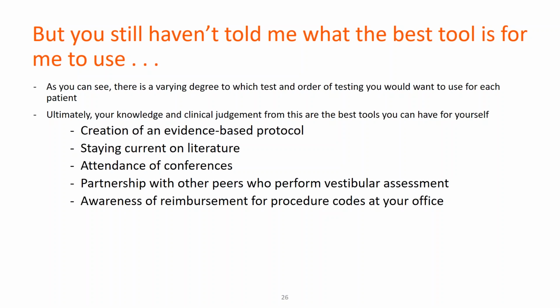Great. And you may incorporate gaze testing to that just to show that there is no other central sign going on. I think ultimately your knowledge and clinical judgment are the best tools that you can have for yourself. So I always, for myself, try to keep as much in touch with the literature as I can. But I think creating an evidence-based protocol, so understanding to yourself why you're including a test, is very helpful.